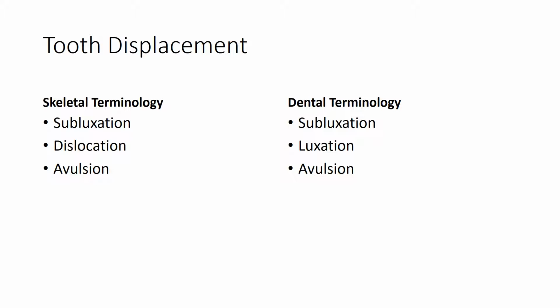So keep in mind the dental term subluxation for mobility without displacement. Radiographically, it's going to be tough for the radiologist to make that diagnosis, although sometimes you can see a little widening of the periodontal ligament. And then luxation should be fairly obvious, both clinically and radiologically. And then avulsion in radiology, you'll just see an empty socket.